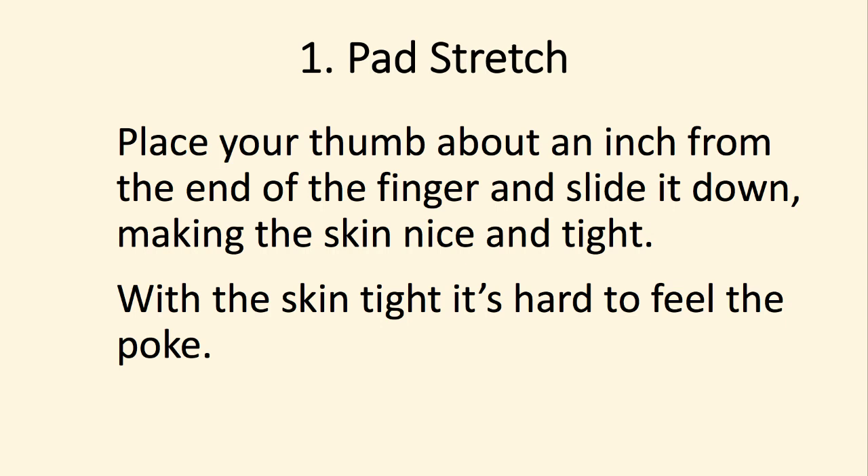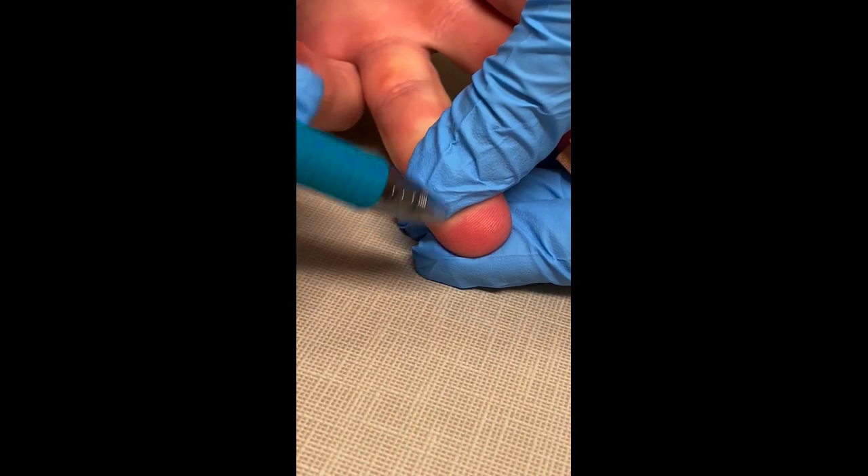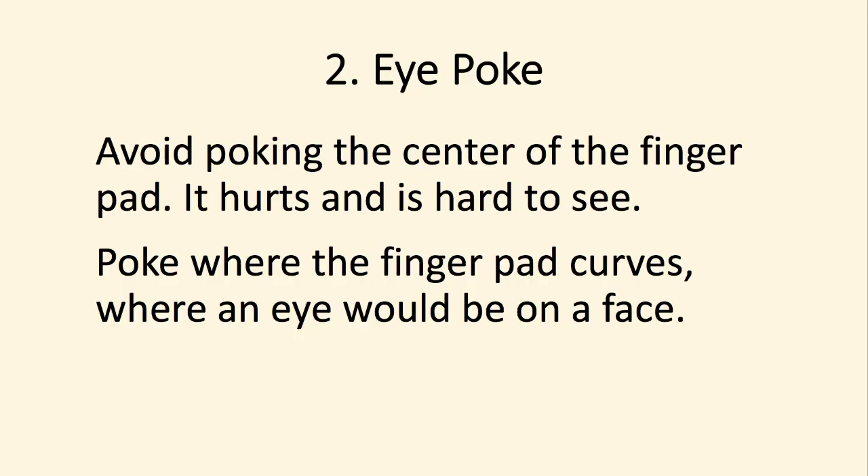The first step is the pad stretch. Place your thumb about an inch down from the end of the finger and slide it, making that skin nice and tight. The reason is that it hurts less when you poke. Poke right there.